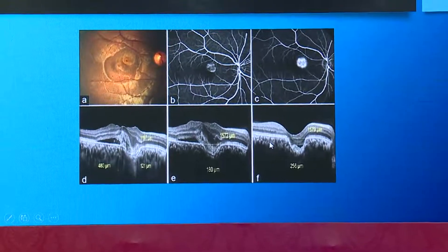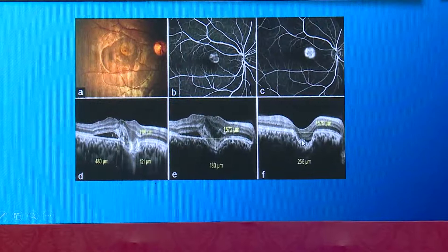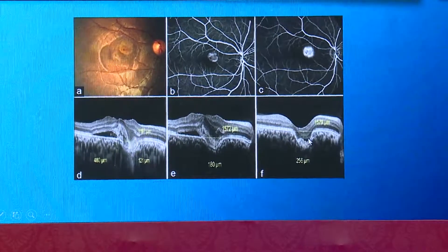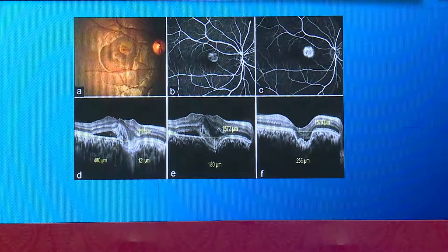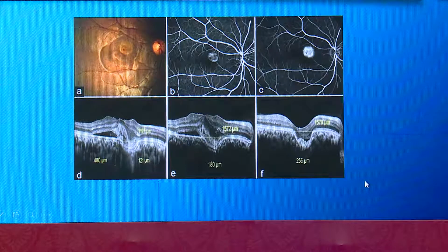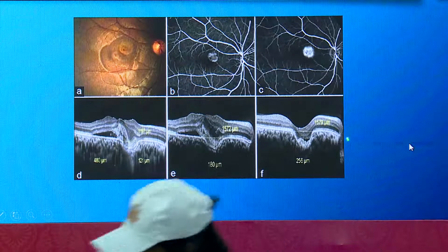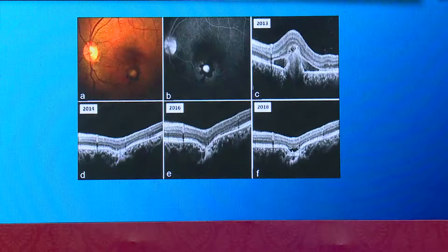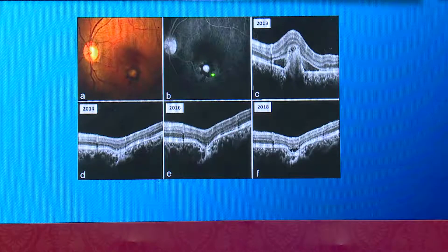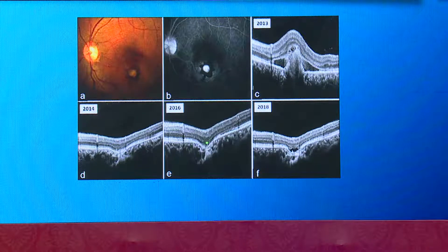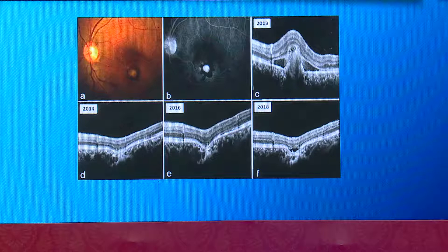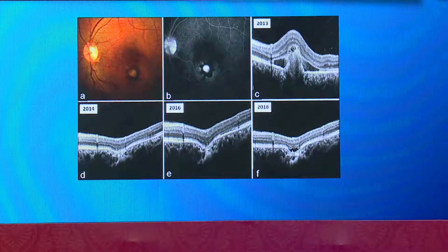The important thing is you can see a fluid-like area at the bottom of the focal choroidal excavation. This is not SRF — this is called non-conforming focal choroidal excavation. This should not be mistaken for fluid and treated unnecessarily. This is a dry macula with a non-conforming type of focal choroidal excavation. In another case, there is classic CNVM leaking in the late phase with subretinal fluid. After treatment it became dry — the conforming type of FCE was present and later it became non-conforming. The transformation from conforming to non-conforming can happen in focal choroidal excavation and should not be mistaken as a recurrence.